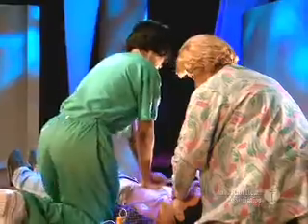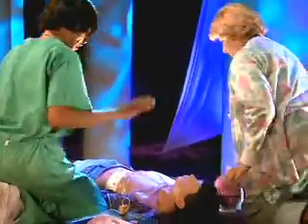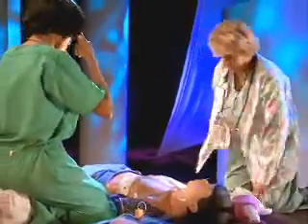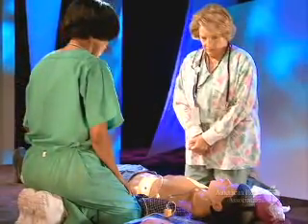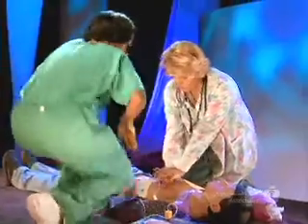After 5 cycles of 30 compressions and 2 ventilations, pause for the AED to analyze. Analyzing heart rhythm. If indicated, press the shock button and switch rescuer roles. No shock advised. Begin CPR.